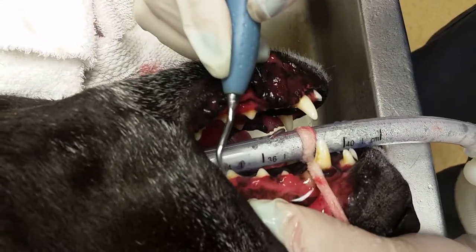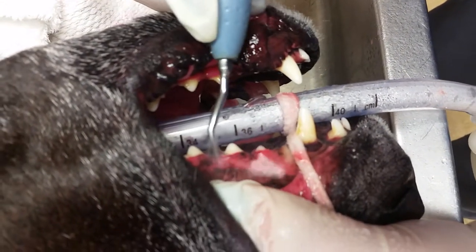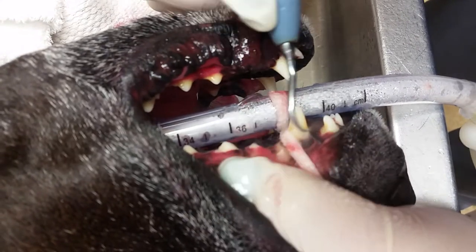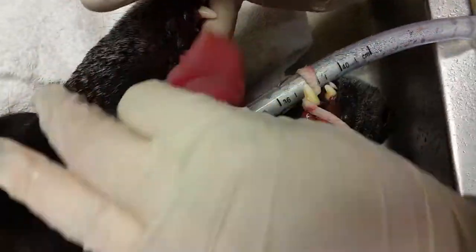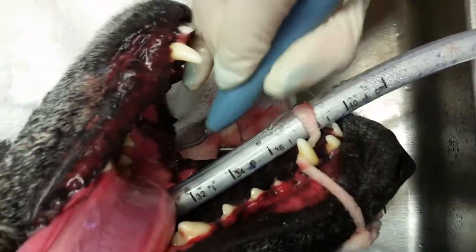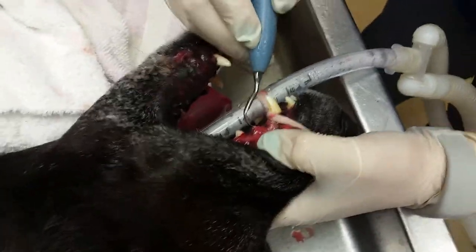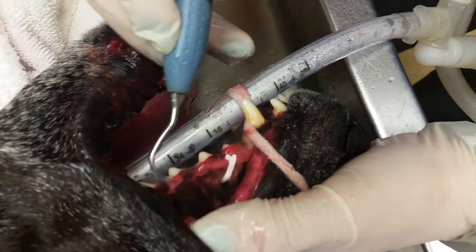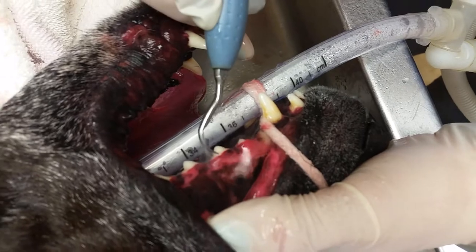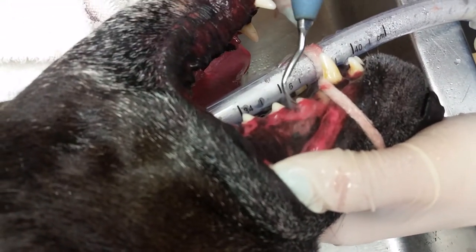When I went to finish my scaling, I'd actually go ahead and do the outsides of both these teeth and then the insides of the lowers and uppers as well. These three teeth are nice and clean though — I don't see any more tartar on them. So I'm going to go ahead and finish scaling and then show you how I would polish them.